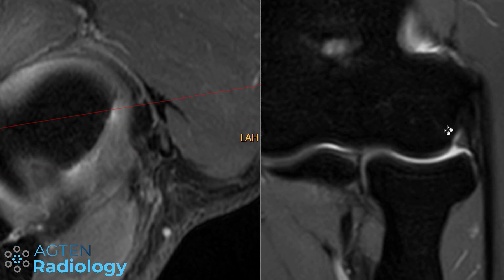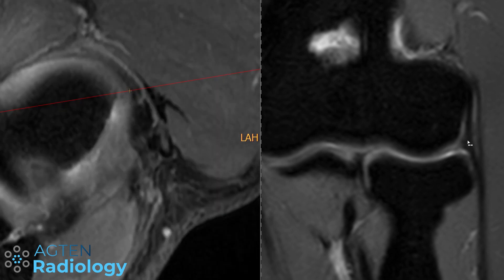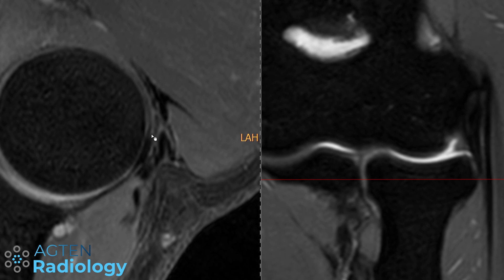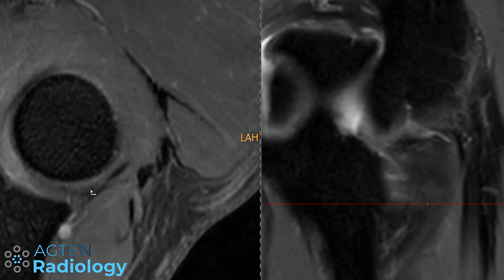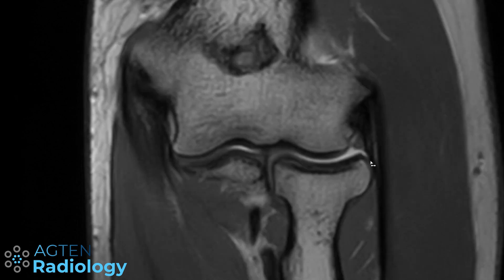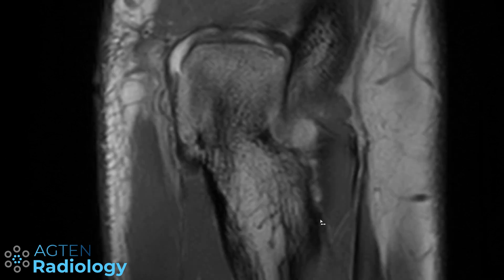Looking again at the transverse sections: anteriorly this is the radial collateral ligament blending with the annular ligament. Going more distally, we can see portions of the lateral ulnar collateral ligament running around the radial neck and inserting onto the tubercle of the supinator crest. This is shown again on a non-fat-saturated PD sequence: the radial collateral ligament blends with the annular ligament, and the broader portion of the lateral ulnar collateral ligament wraps around and inserts onto the crest.